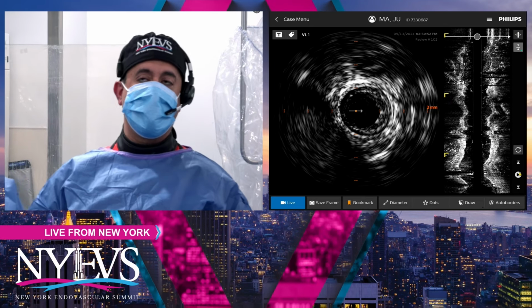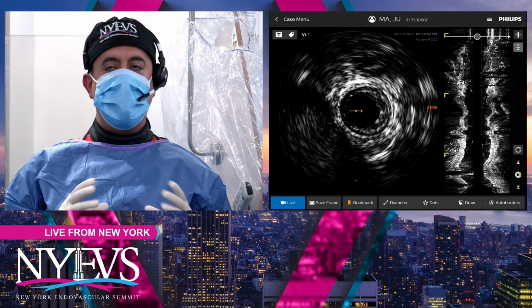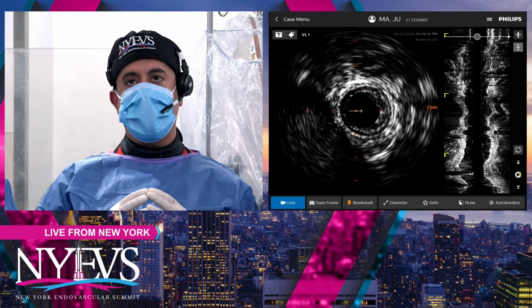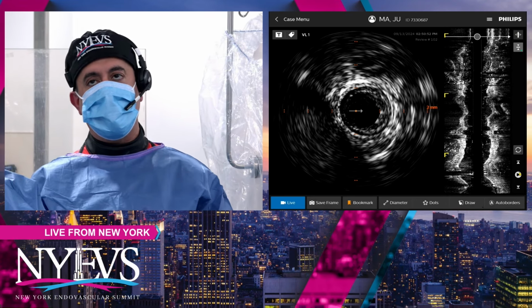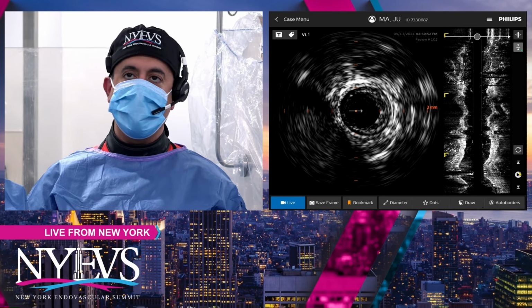Just a quick question, Dr. Zeller. Does the IVUS and the thrombotic burden ever change his decision for putting a filter in? I know he said he's never put it in, but let's say with IVUS, we prove that the thrombotic burden is significant. That also doesn't warrant putting a filter in, or we still do what we do, which is straight up Rotarex and hope that nothing goes down?